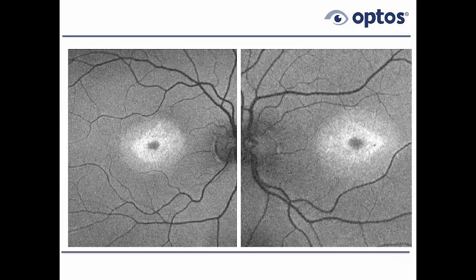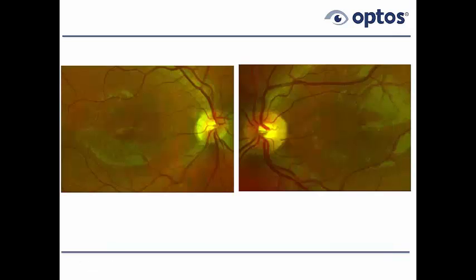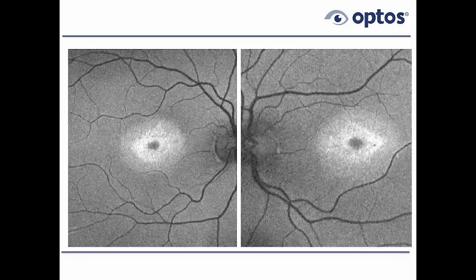You probably will find abnormalities on OCT, and if you happen to be one of the few people out there that have various pattern ERGs, the pattern ERG or, more likely even, the multifocal ERG will be abnormal. So in any instance, a lot of these toxicities, Plaquenil toxicity, even Accutane, the acne medicine, has at least 2 cases that have been published, have similar types of bullseye lesions.